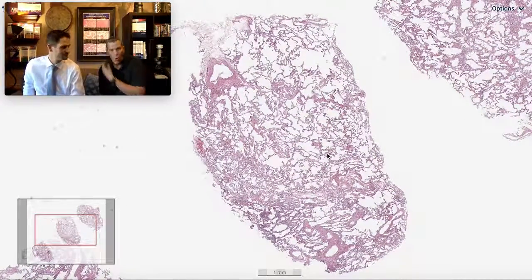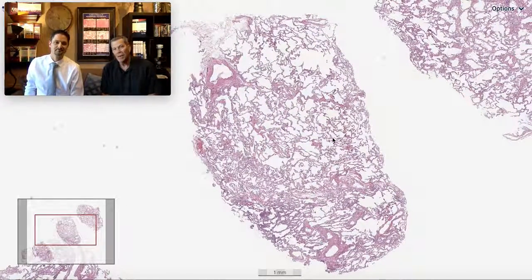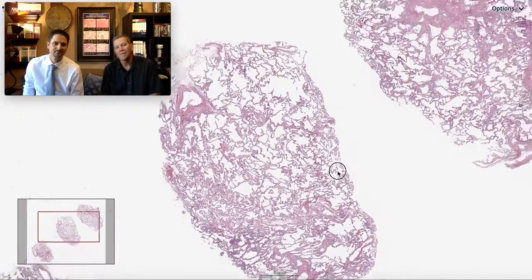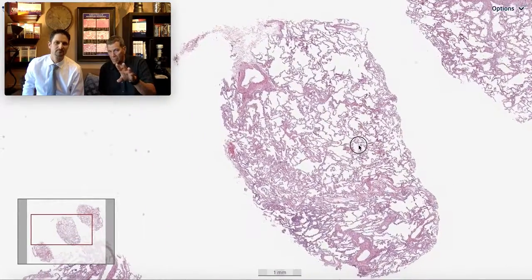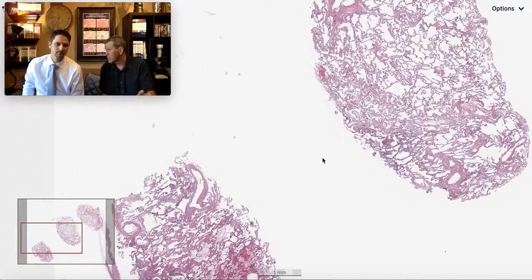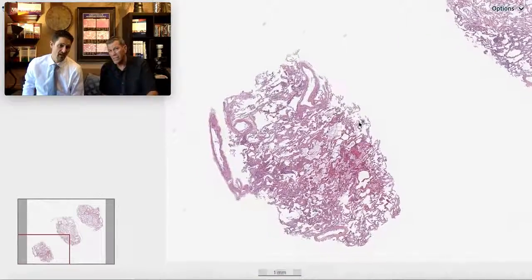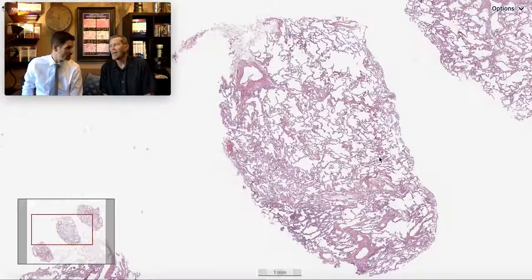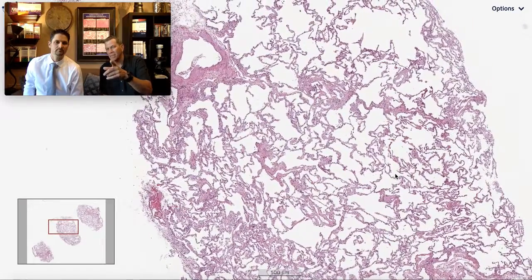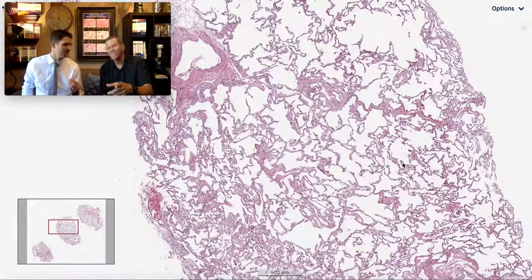The adage of do no harm sort of becomes center stage for this. And the cryobiopsy, when done well, will yield a specimen like this — eight to ten millimeters is a good size. Look at the preservation. This biopsy shows the lung as it was snap frozen in its physiologic state. We don't see that in surgical wedge biopsies, which are taken when the lung is collapsed.